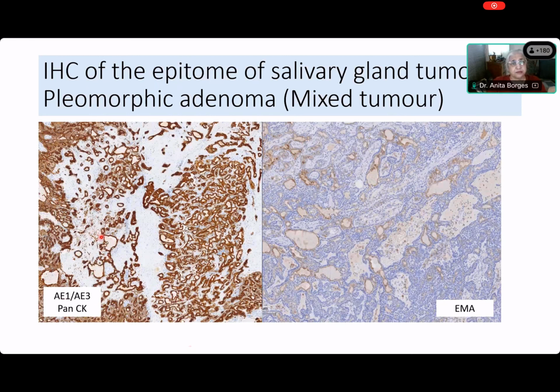What do you see in pan-CK, Shivani? Ma'am, what has taken up the stain? Pan-CK is positive for the epithelial components and the ducts. Shivani, just hear yourself speaking. Epithelial components and the ducts. What do you mean by epithelial components and ducts? Ducts have got epithelial components or not?